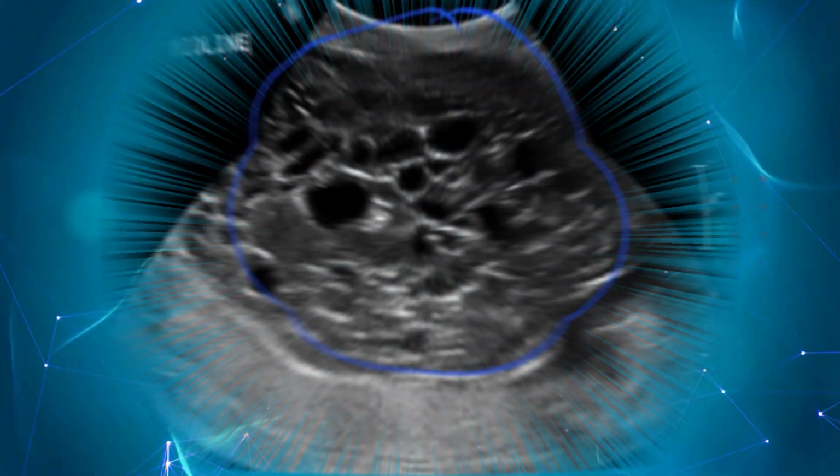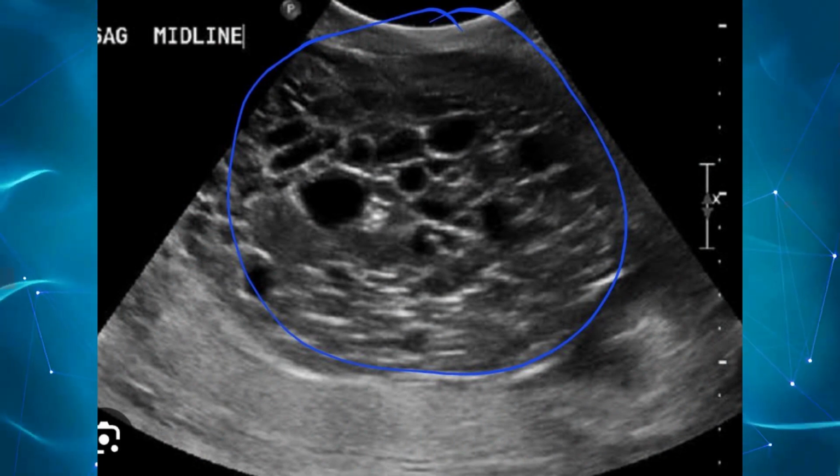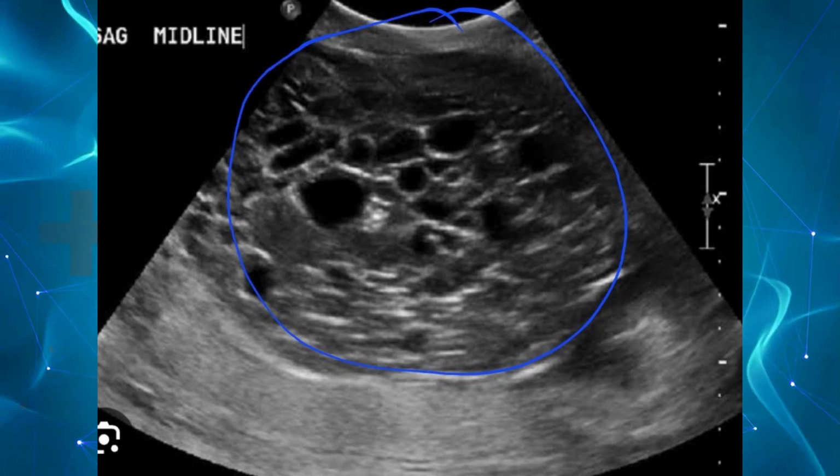And sometimes in these masses, we might be able to see some embryo or maybe some placental tissue within the mass, but sometimes it's just a mass that forms in the uterine cavity. And what happens is, when you conceive, sometimes you'll start seeing bleeding that comes and stops, looks like fresh blood. And then it becomes more as you go towards the 3rd month, 4th month, and 5th month. The bleeding becomes more and more.